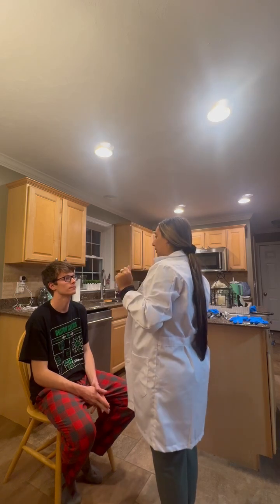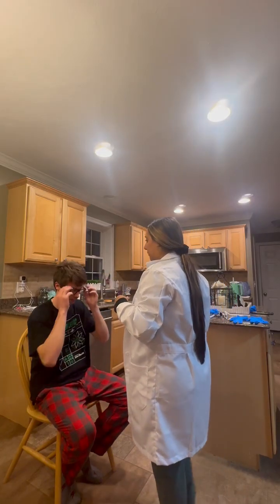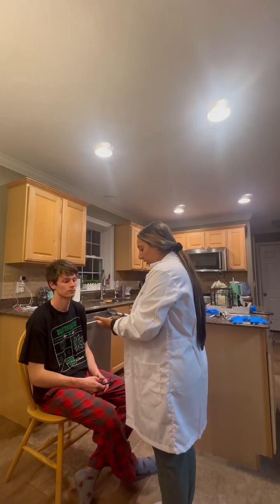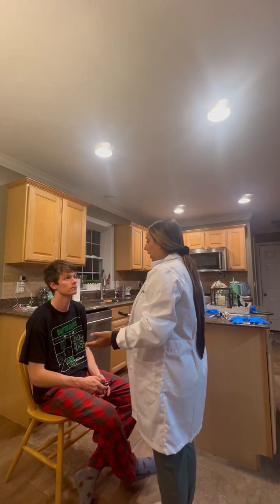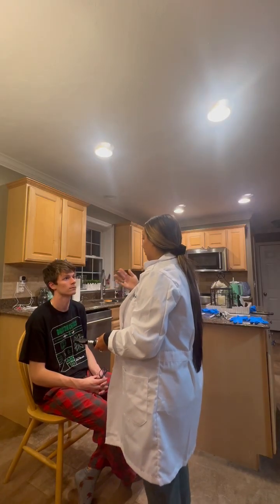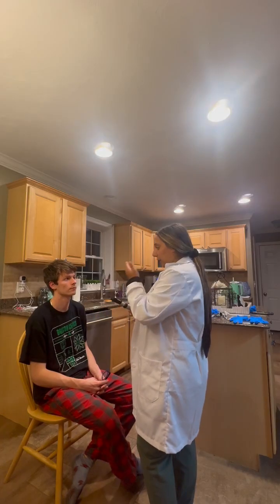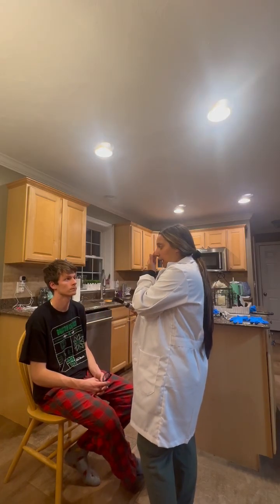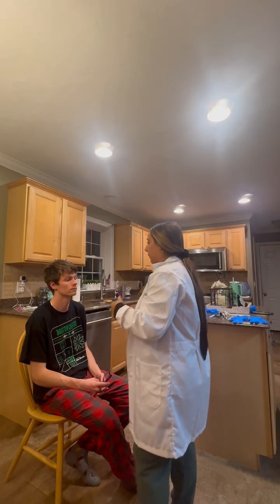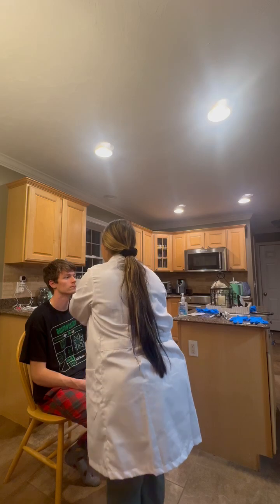Yep. Alright, now we'll get right into your fundoscope exam. I'll have you take off your glasses. Okay, so I'll be visualizing the inner parts of your eyes. I'm going to use my right eye to visualize and inspect your right eye, and then I'll use my left eye for your left eye. Okay? So you're going to feel a shining bright light into your pupil, and then I'm just going to visualize the inner parts of your eye, and then I'll take it away. Okay? You ready? Yep. I'll just have you look at the doorknob and keep your eyes staring at the doorknob.